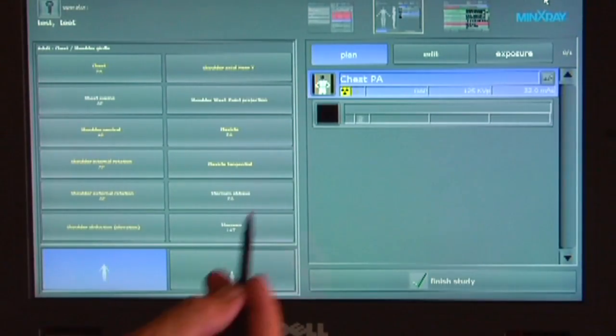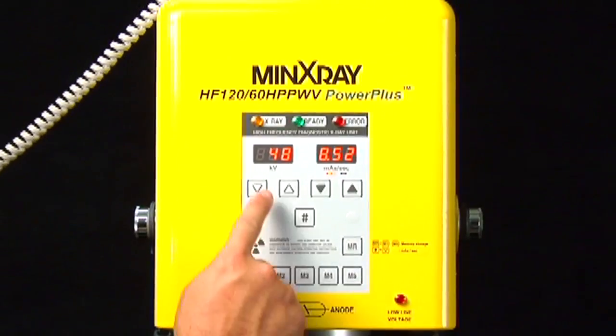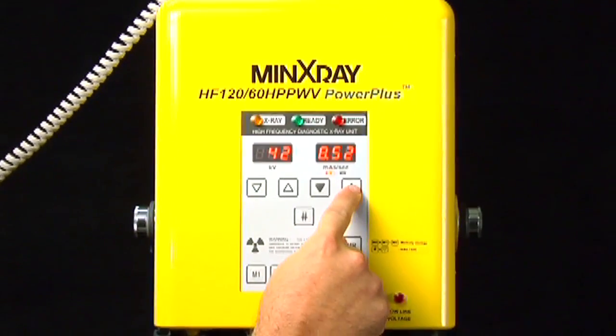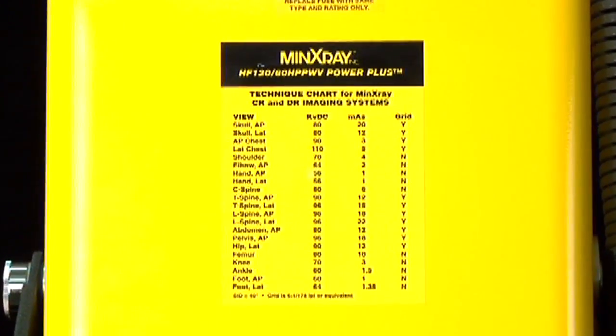Select the position to be imaged. Set KVP and MAS on the front of the X-Ray tube head according to the techniques on the technique chart provided.